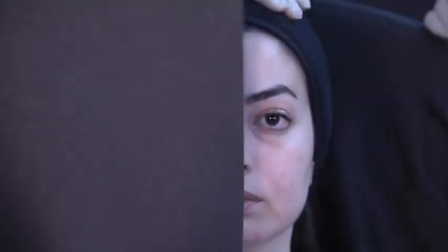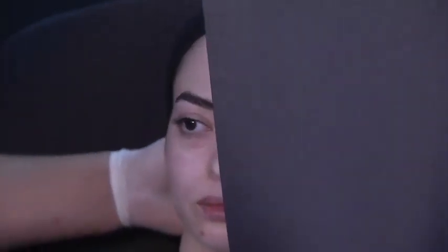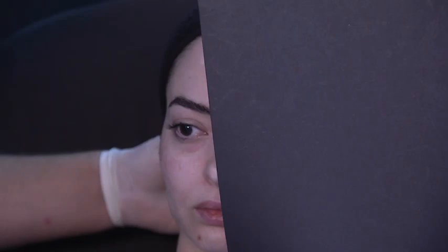Can you zoom better, cameraman? Could you show like half of the face? Sure. Look at the different depth of the points. Here you can see clearly what is on skin, what is on fat, and what is on bone. Zoom out a little bit, just a little bit, that's it.